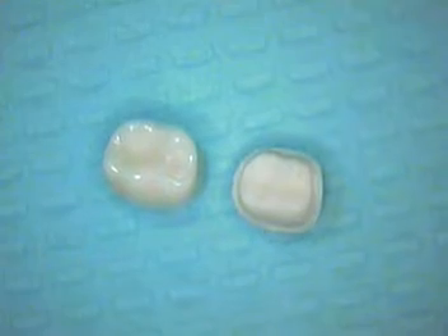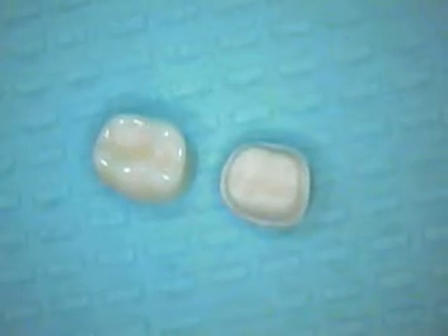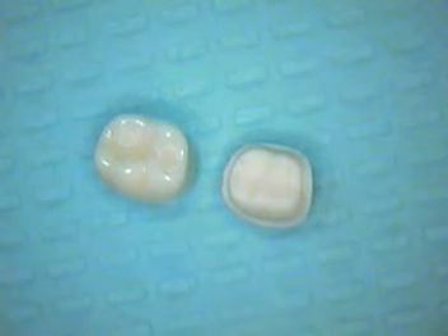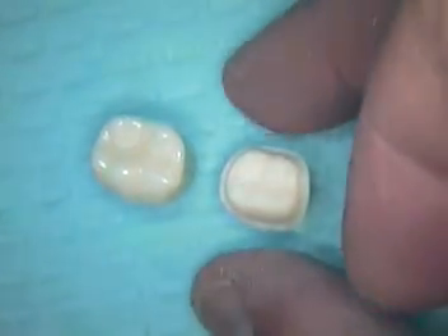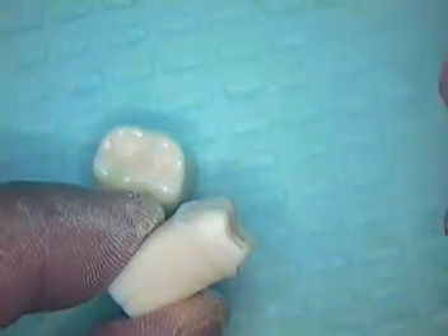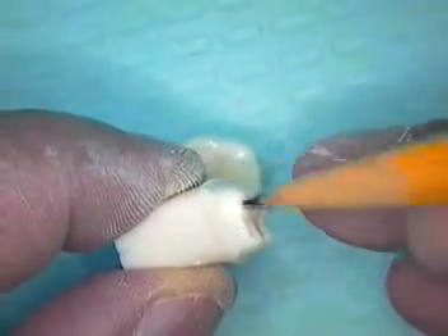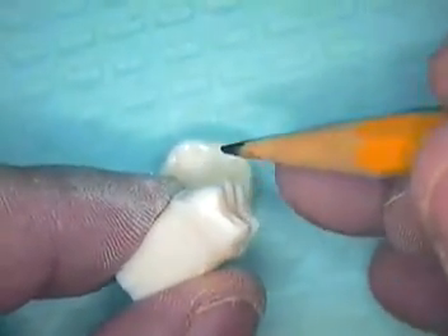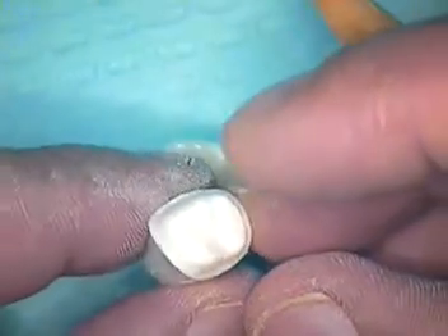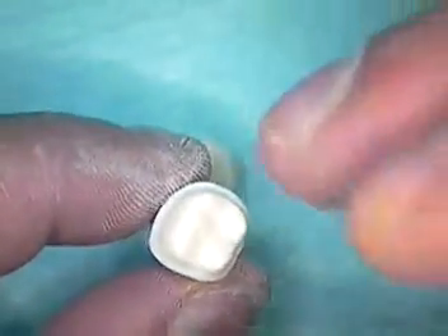We've discussed earlier how the tooth preparation is divided up into three planes, and we demonstrated both the occlusal reduction as well as the vertical reduction, keeping in mind to stay parallel with the long axis of the tooth and allow the burr to shape and give the angulation necessary for the path of insertion or the path of withdrawal.